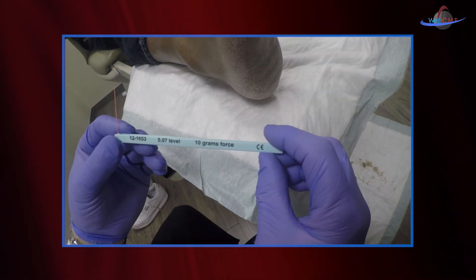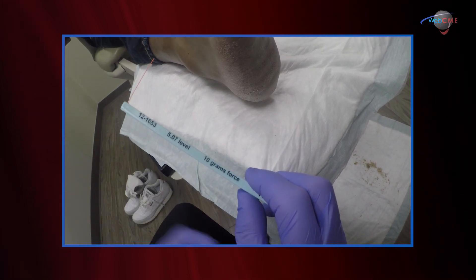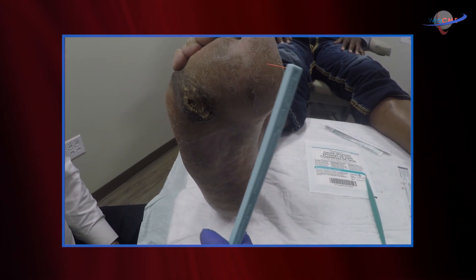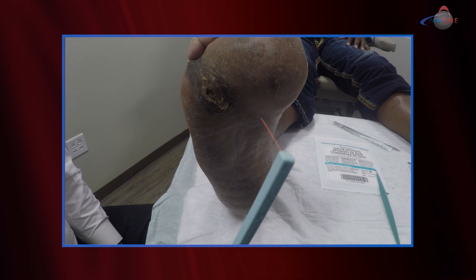How do we assess for neuropathy? One of the best ways is to use monofilament testing. Here is a device we can use to assess neuropathy — essentially, it's performed by applying just the force of the monofilament with some downward pressure, and we ask the patient whether they can feel that. We're going to test certain areas of the foot.